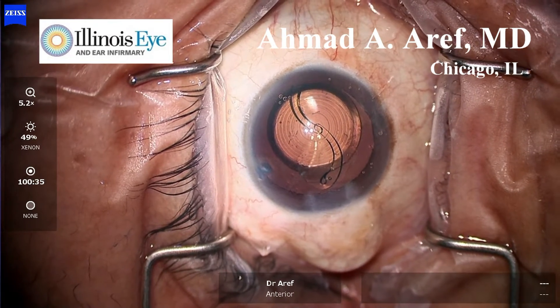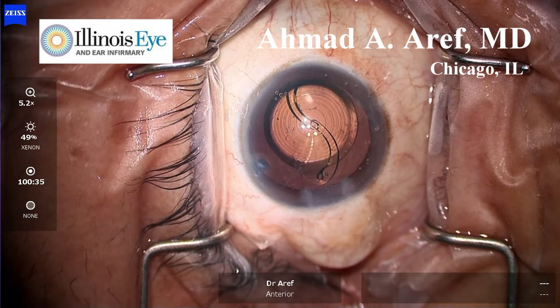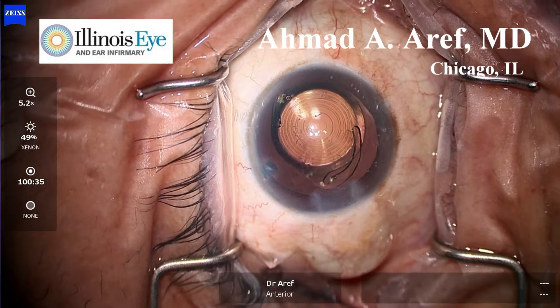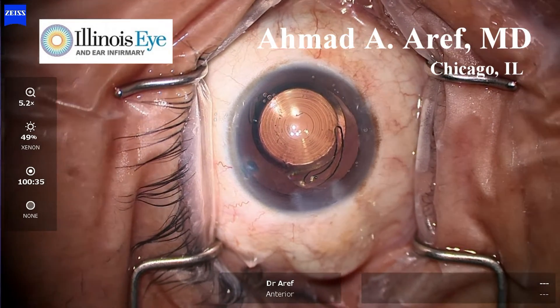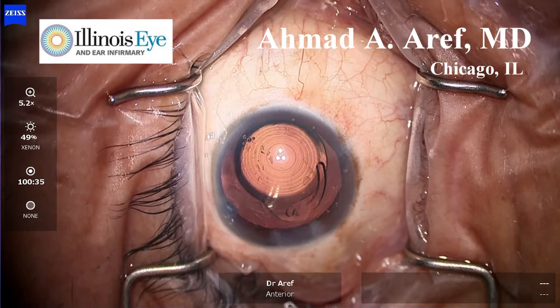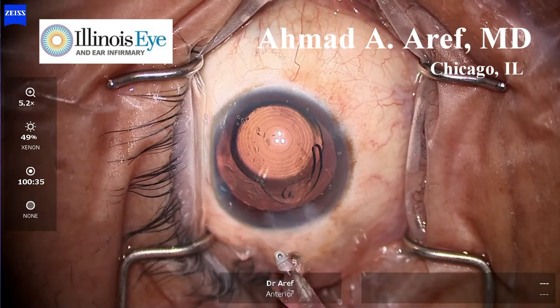Sometimes the intraocular lens haptics may be stuck together, as seen here. Often just giving this a little bit of time allows for the haptics to become free from one another. Sometimes a second instrument may be required. This situation is not encountered frequently.